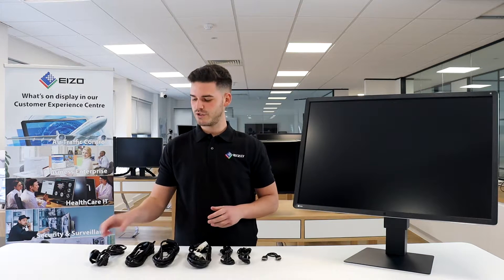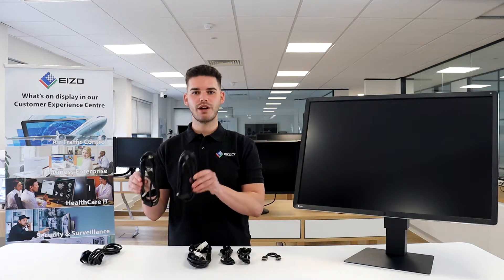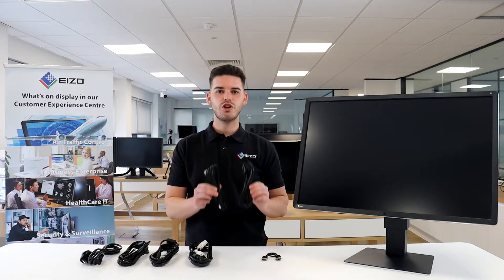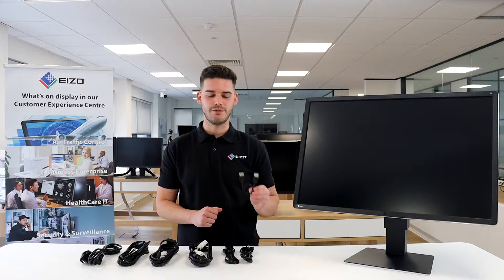The cables found in the box include one UK power cord, two DisplayPort cables, one DVI cable, two USB A to B cables, and finally one mini DisplayPort cable used for daisy chaining.